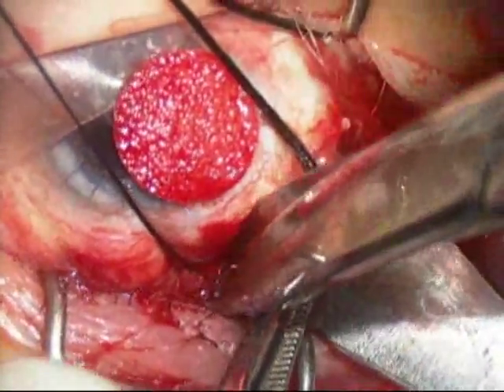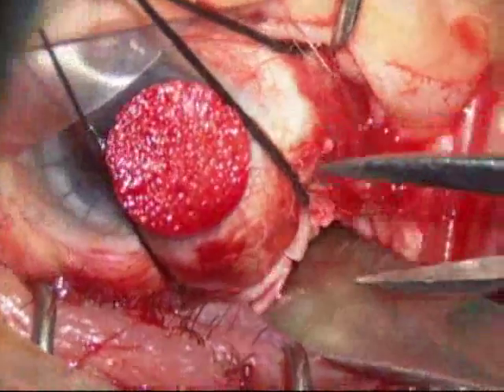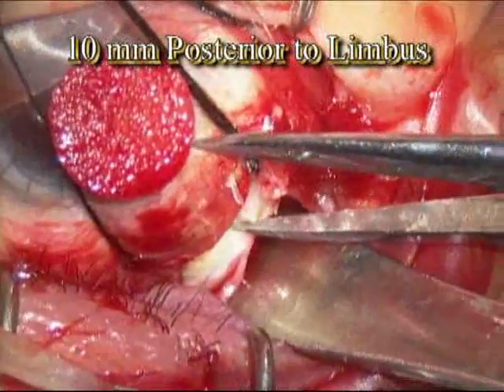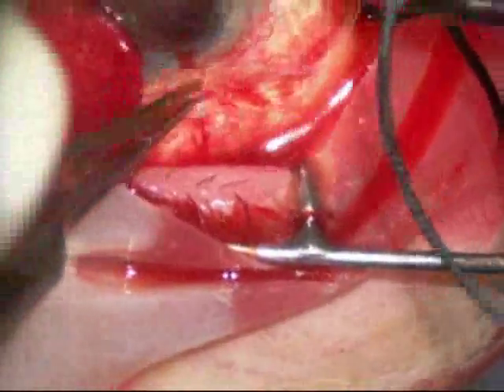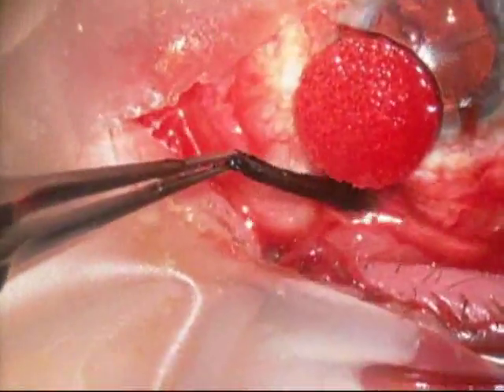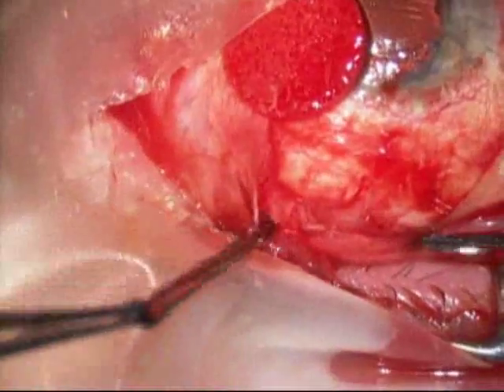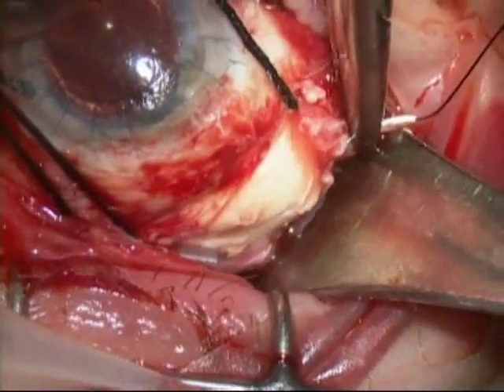This particular patient had the scleral buckle placed about a year or two prior to this surgery, and therefore the dissection down to the scleral buckle was a little complicated because the buckle had been encapsulated. One of the reasons we're reluctant to remove scleral buckles is because there is a slight risk of retinal detachment on removal of a scleral buckle.